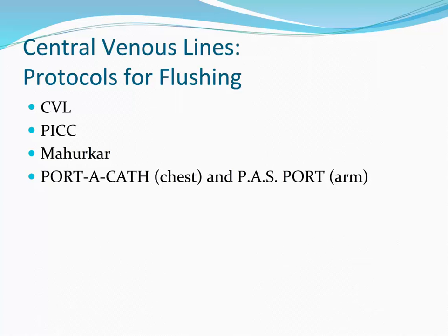Check the venous and arterial ports and you will find the catheter volume displayed in mLs printed on the port itself. It is usually somewhere in the neighborhood of 1 to 1.5 milliliters and is based on the length and lumen size of the particular catheter. That is why it varies. However, it is not uncommon for the providers to order a standard 1 milliliter flush.